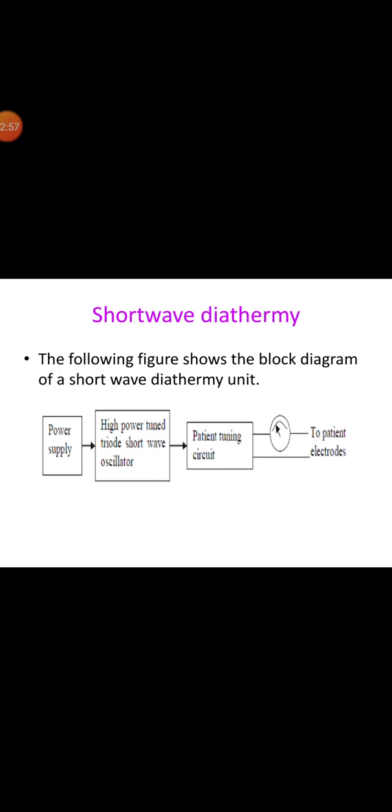Similar to other methods for applying energy to the body, shortwave diathermy can be applied in two distinct modes, that is continuous and pulsed mode. When continuous mode is used, the tissue being targeted becomes heated as the waves constantly convey energy to them. Pulsed mode is used when less heat is desired for the affected tissue.